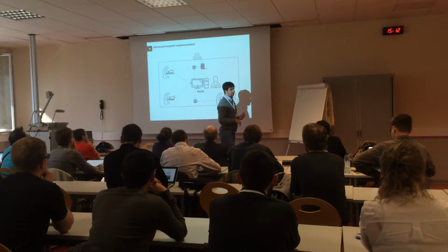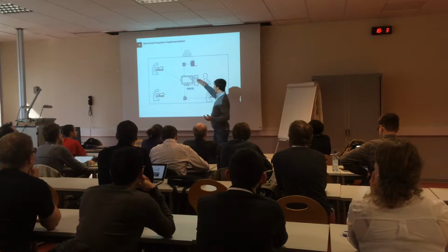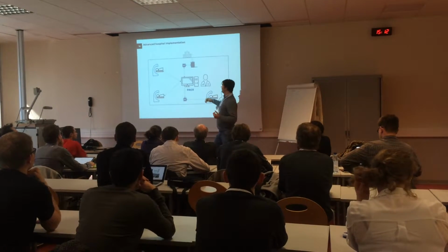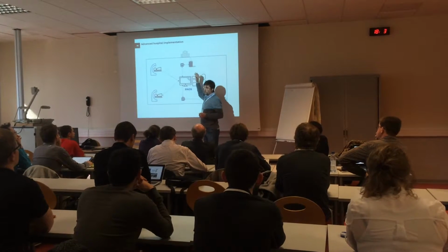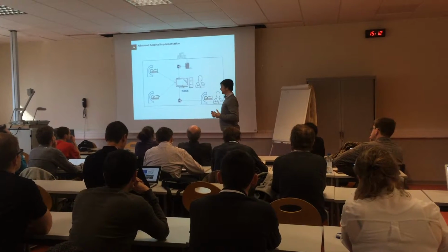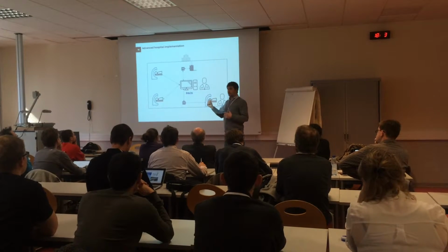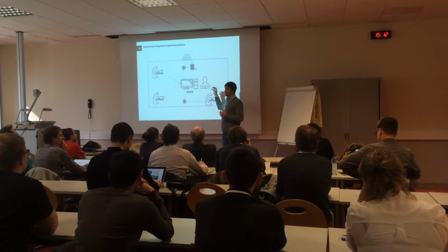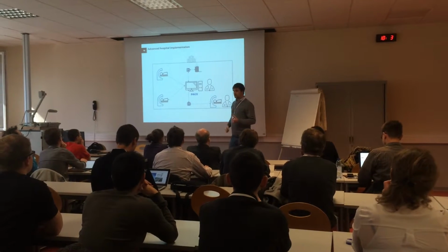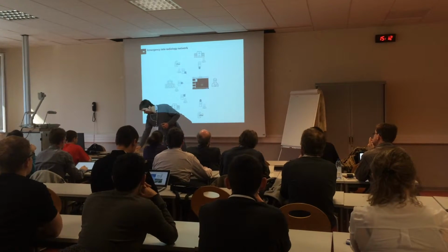The second implementation is actually the one that Sebastian got to start working on, because they had to get the images from the PACS to the radiotherapy center. Had to integrate images from other hospitals, other sources. So he started working on CD ingestion and enabling sending images from that Orthanc instance into the PACS and then getting it back out of the PACS so it could all be sent to the radiotherapy center.